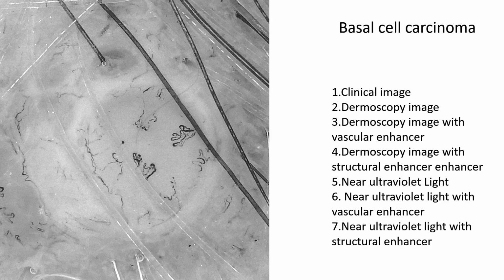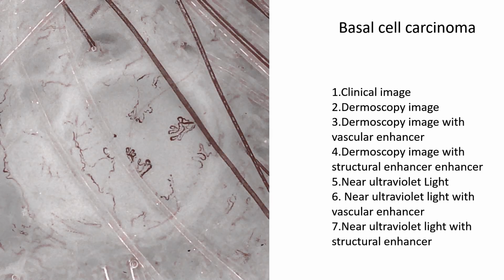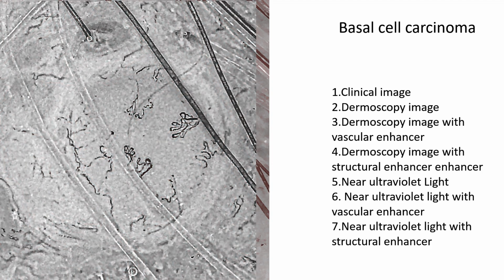In the near ultraviolet light, it's actually seen best, as well as the near ultraviolet light with the vascular enhancer. In the near ultraviolet light with the structural enhancer, it's equally as good. So this diagnosis is best made in the near ultraviolet light mode.